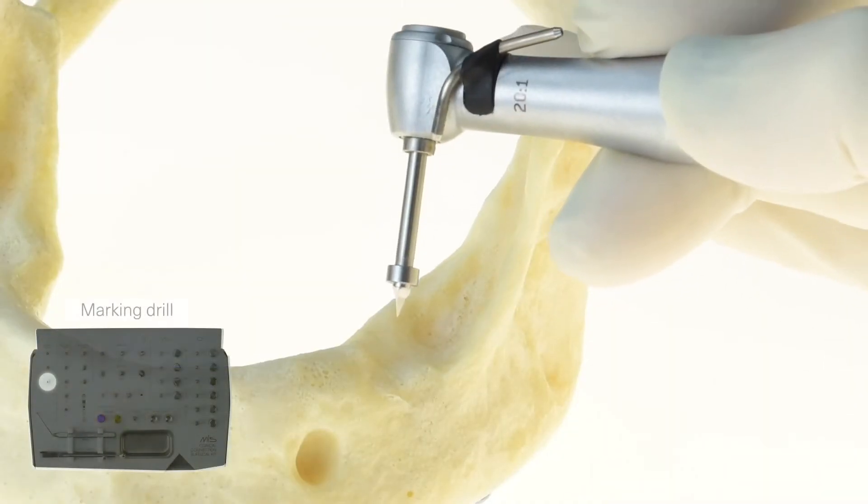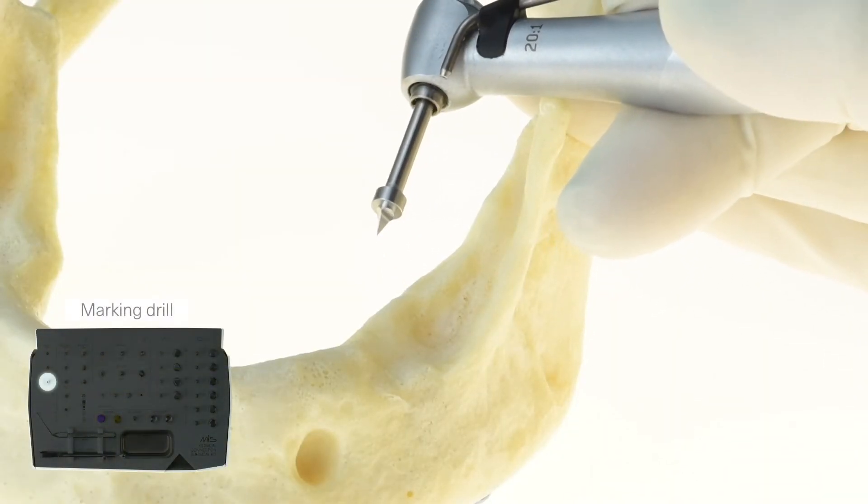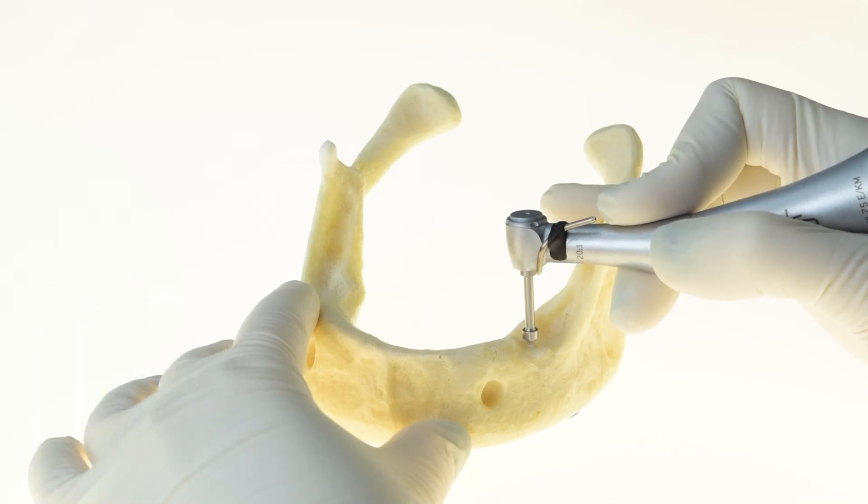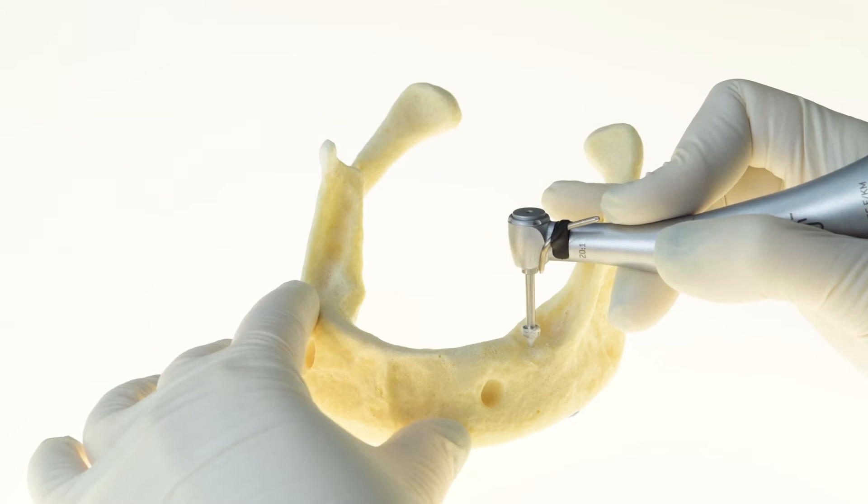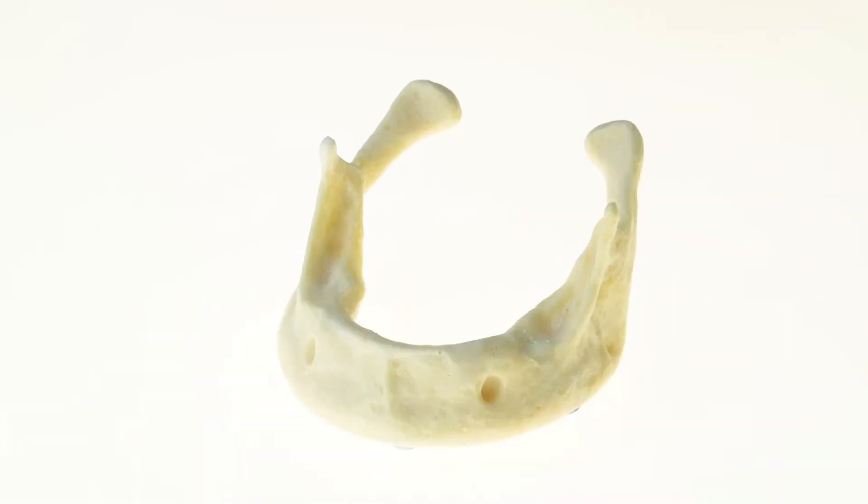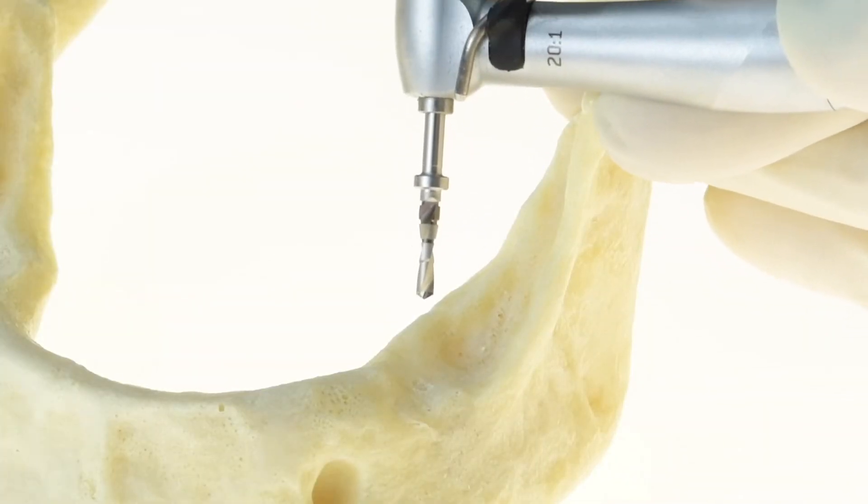The marking drill is used to start off the drilling sequence in an accurate manner. Its ring has a 4 mm diameter indicating the final implant position. After marking the correct drilling spot, we continue with the pilot drill.